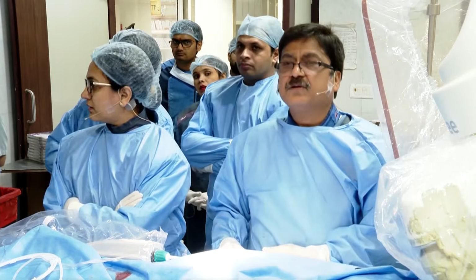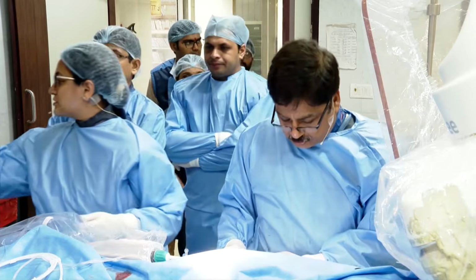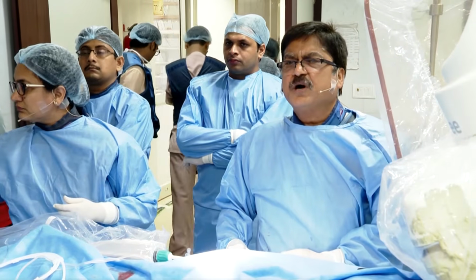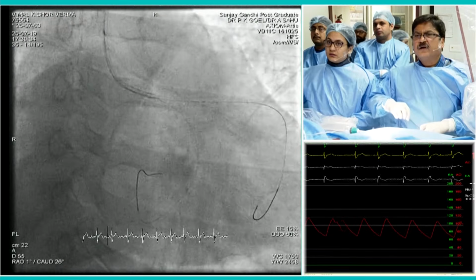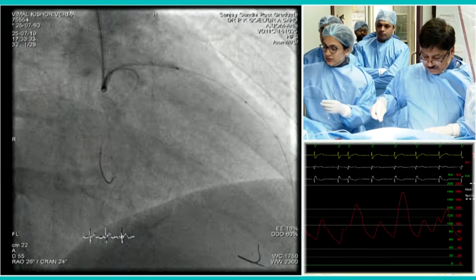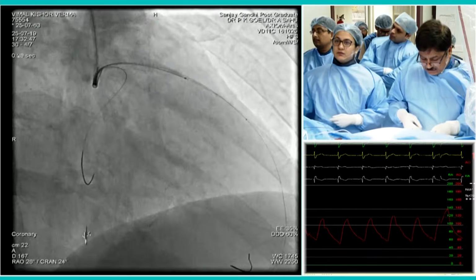Yeah, okay. So, as I told you, I had put the stent, you saw me putting the stent there. Yes, we saw the picture immediately after the stent. You were taking the post-dilatation balloon. At that stage, we left you. Yeah, so then what I did was I did a post-dilatation with a 4.5 NC of the left main, okay?